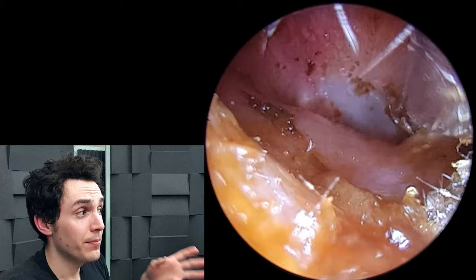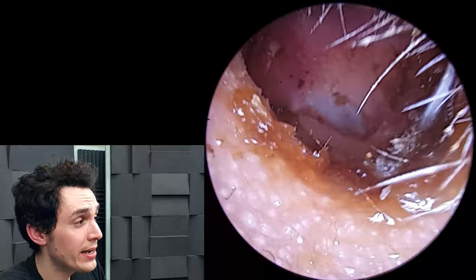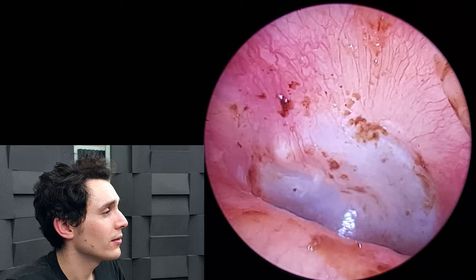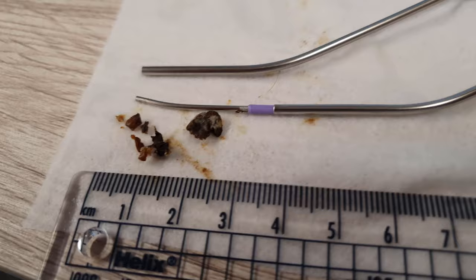This soft brown wax around the exterior is pretty good — pretty healthy given the fact that the patient has recently had otitis externa. I don't want to get rid of all of this — I just want to clean up the bits of dead skin, because that's not good. But ordinary soft brown wax is fine and will protect the patient from future infection.